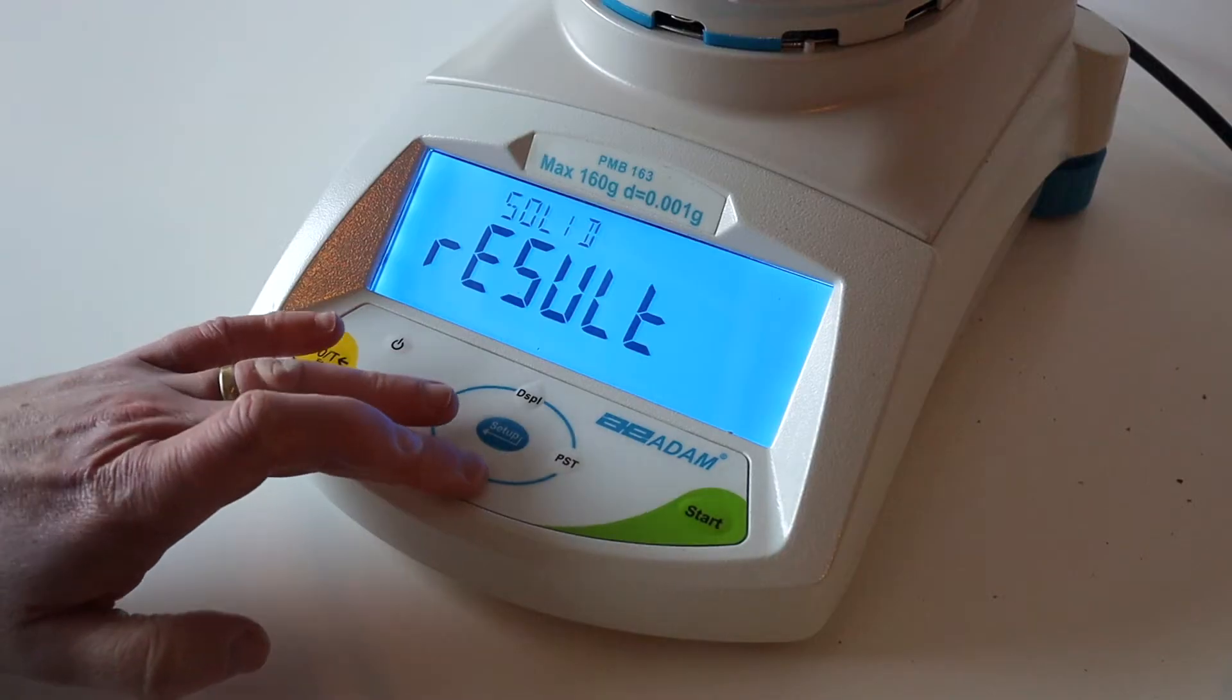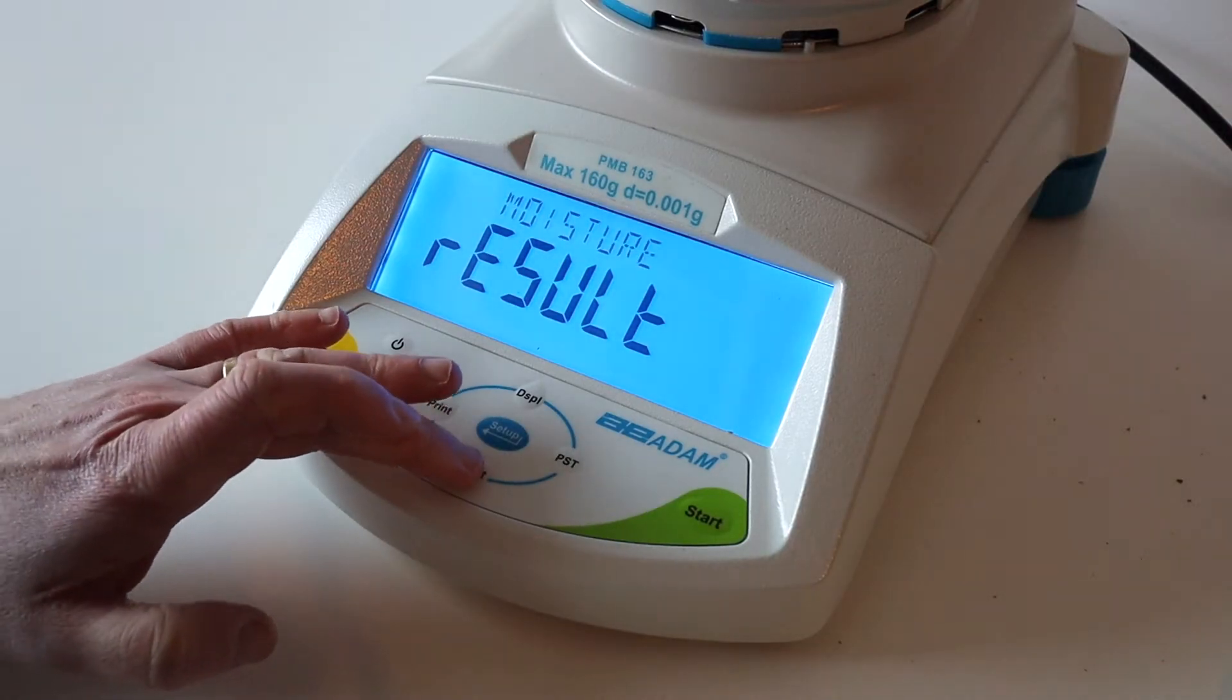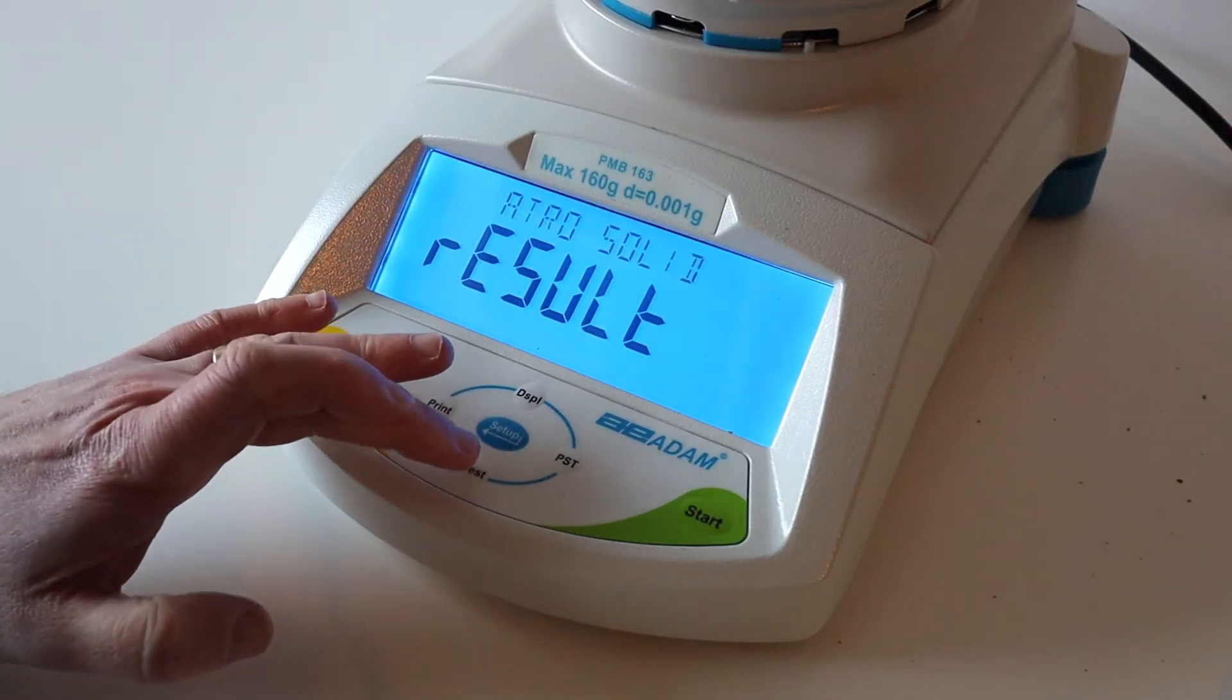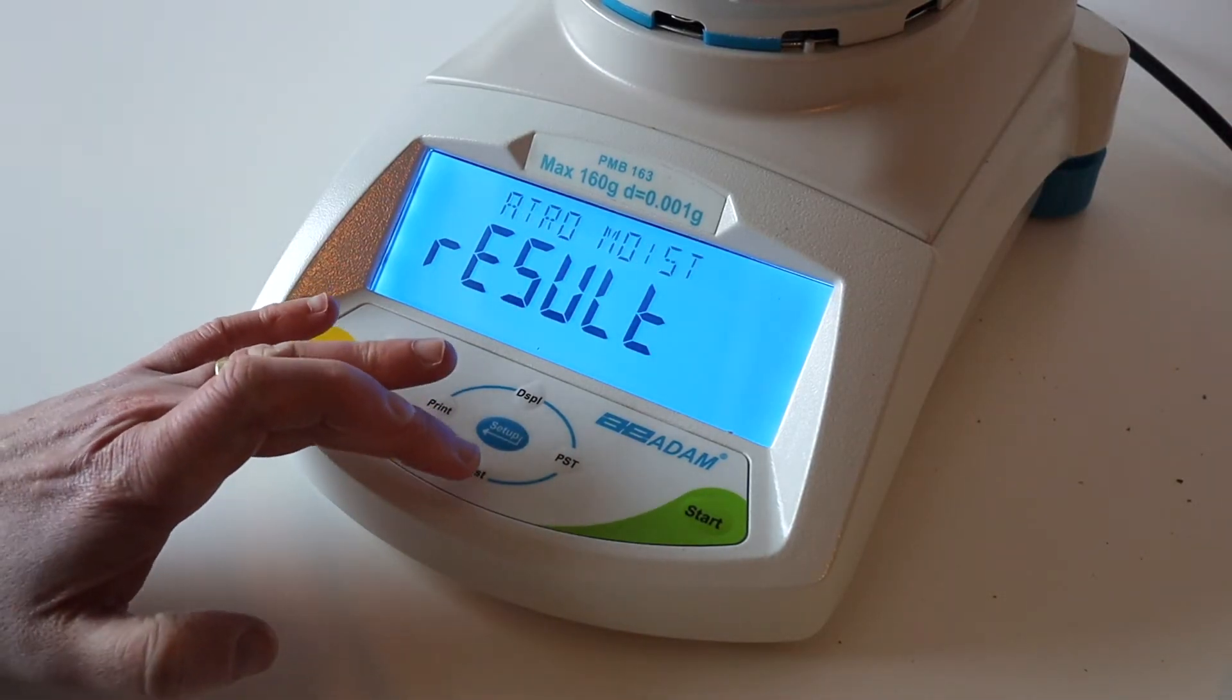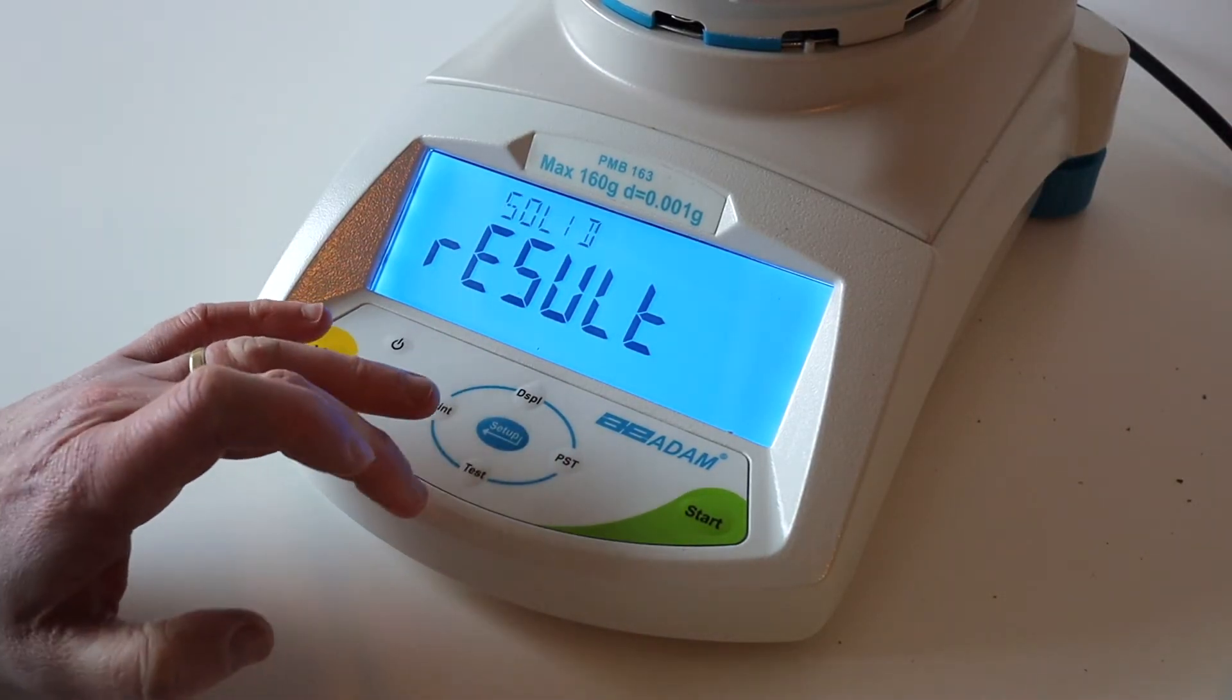Press Test until the display shows solid or moisture and press Setup.